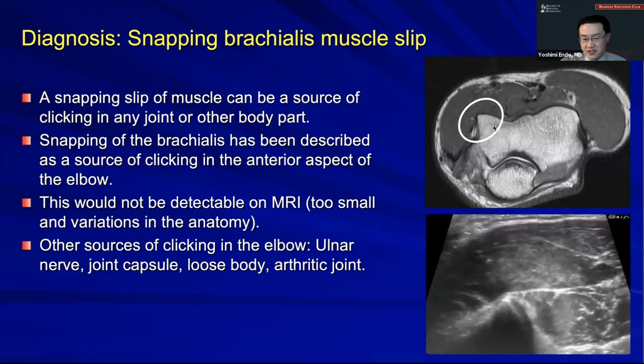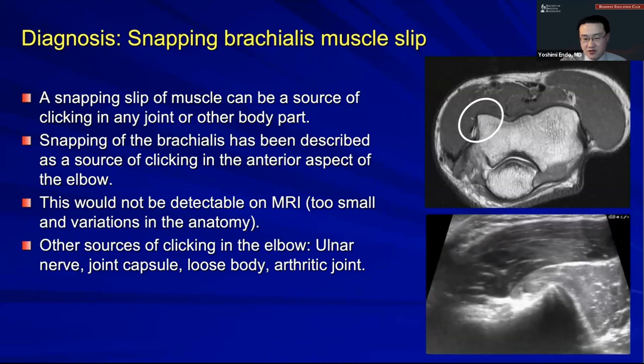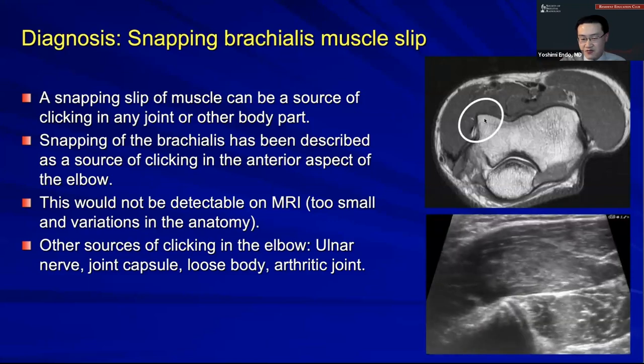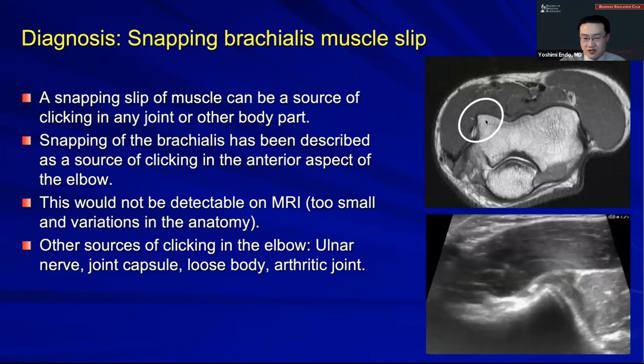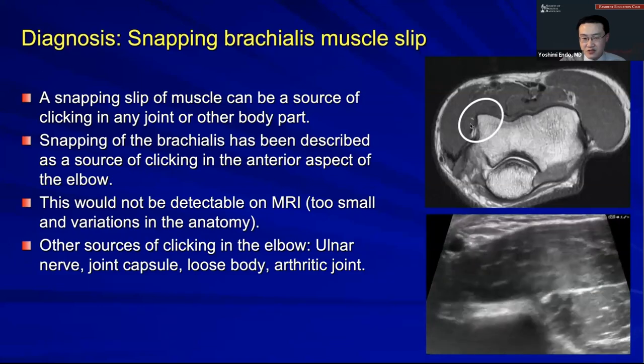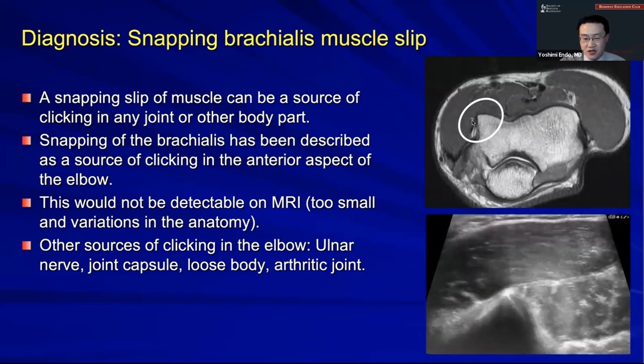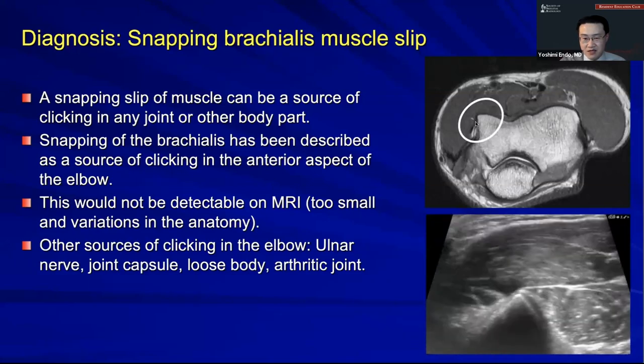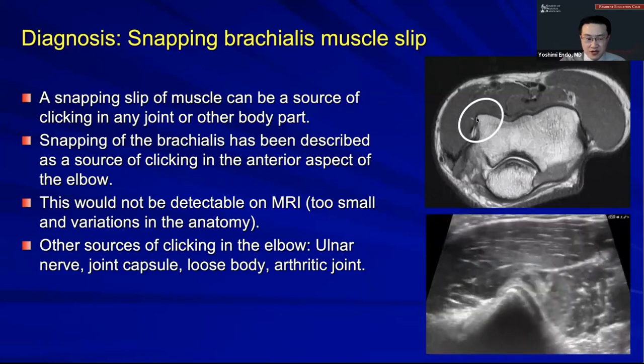For those of us who read these MRIs all the time, we're not really focusing on something small like this. It isn't part of our checklist when we're looking at this. So if there's some subtle variation in anatomy, we would never be able to identify it if we're just looking at the MRI.